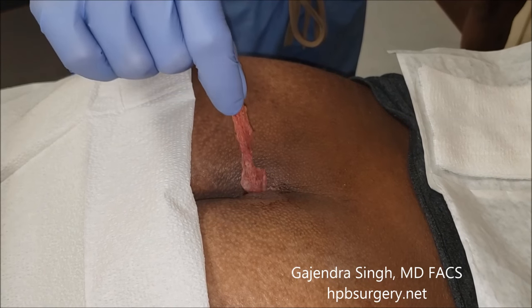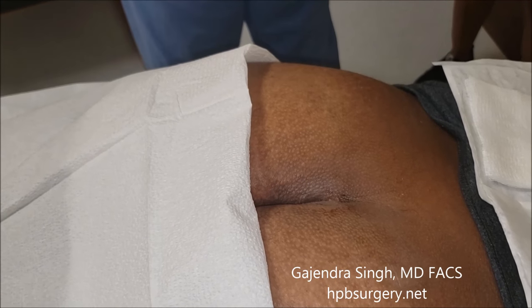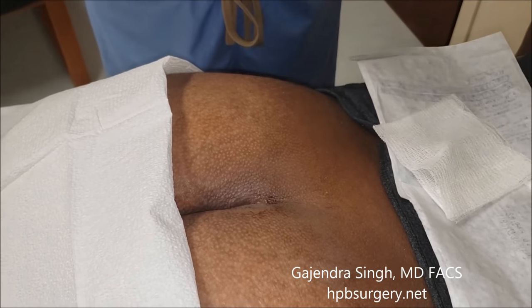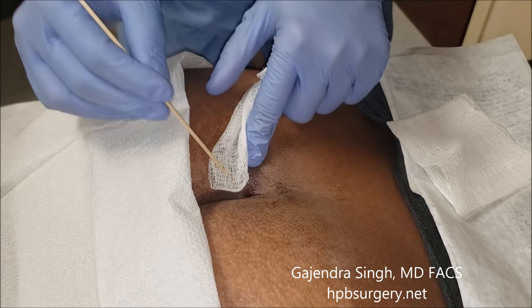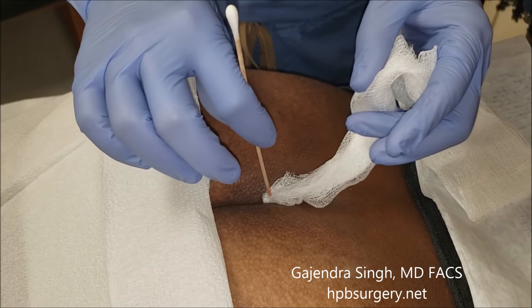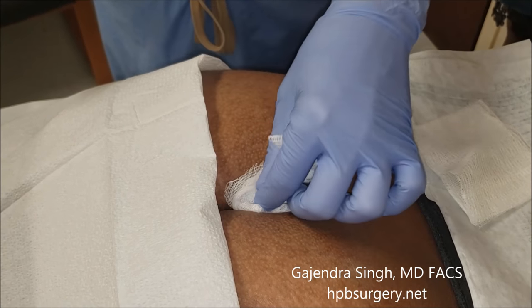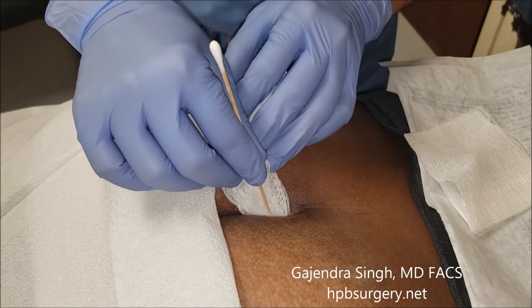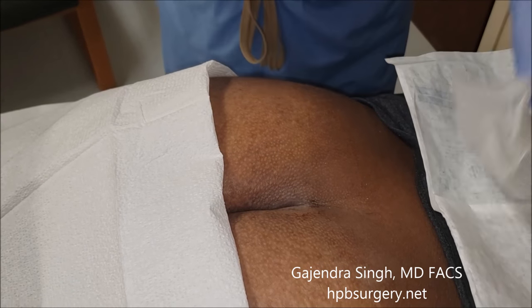We're going to take the packing out today. The first time it hurts, but after this it gets better and you don't have to pack it all the way. Same as in the last video, I'm going to take this gauze — use the wooden end, not the cotton end — and push it in, then roll it a little bit. Our goal in the first few days is to make sure all the pus comes out. The pain happens in the first couple of days and then gets better. Push it in, clean it out, and it should all look clean and bloody — that's a healthy sign.